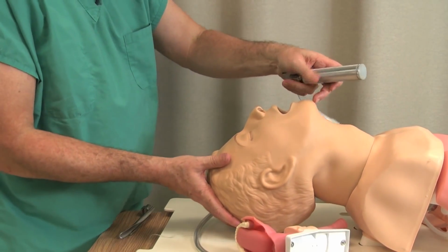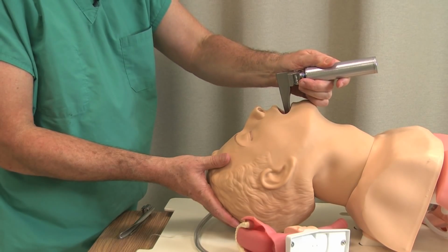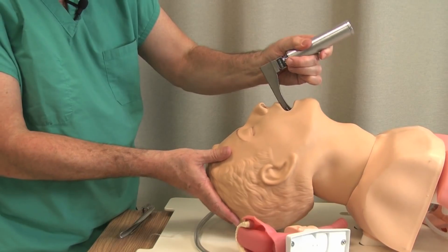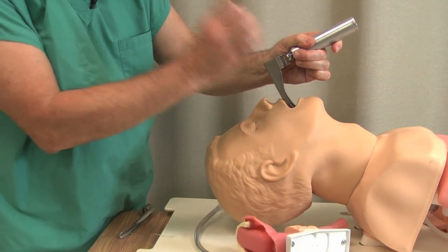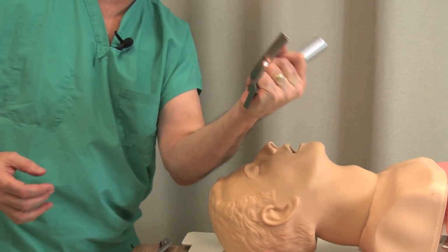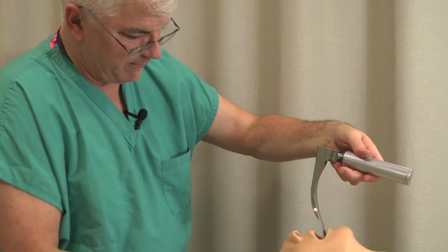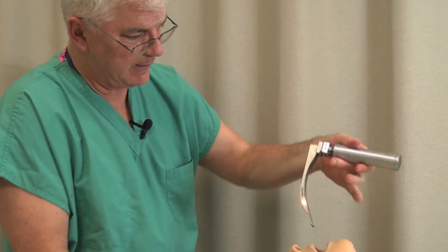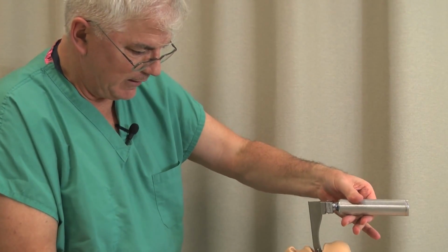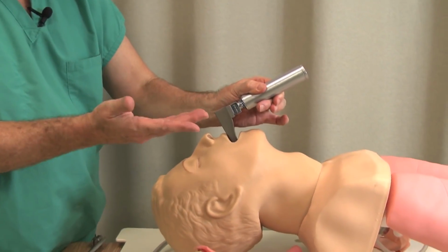This is review. Good head position. Way to the right. Lift. The epiglottis comes down. Lift again and put the tube in. You notice this isn't a muscle affair. This is not a strongman contest. The idea is to do this with technique. See, I can do this with just my thumb and my finger. If you get it to the right, and then just lift a little, that really helps.